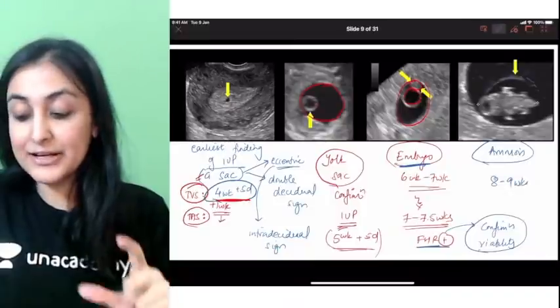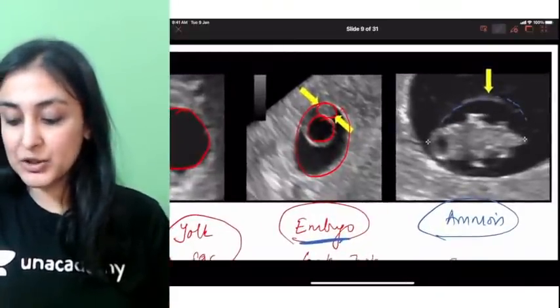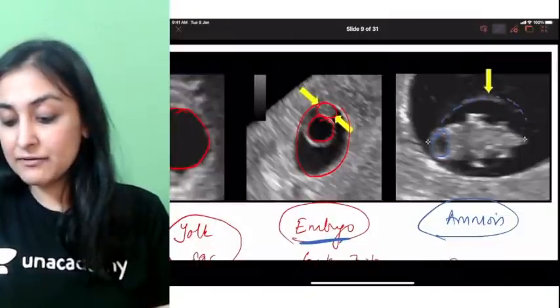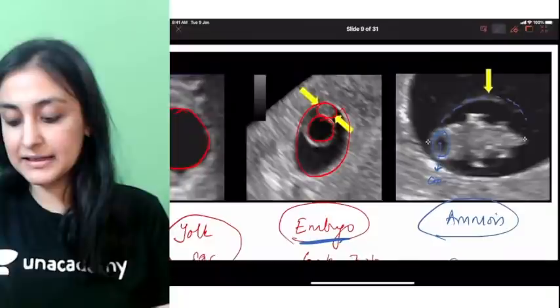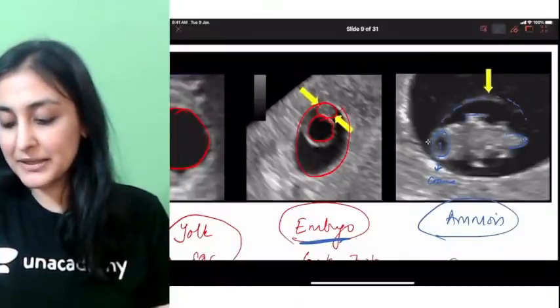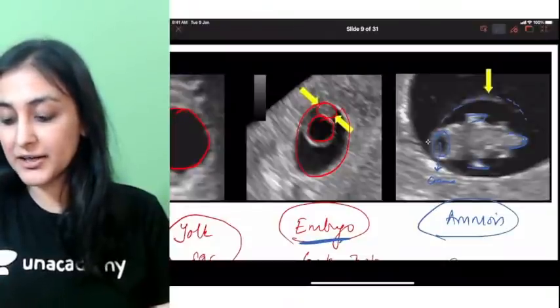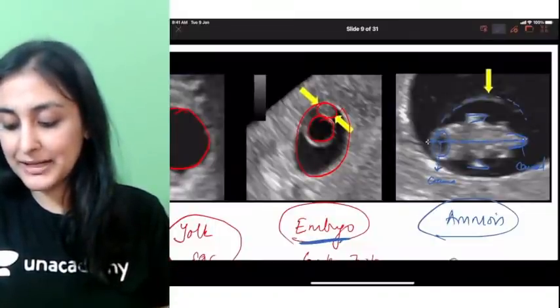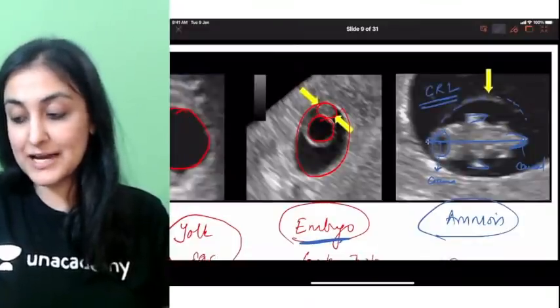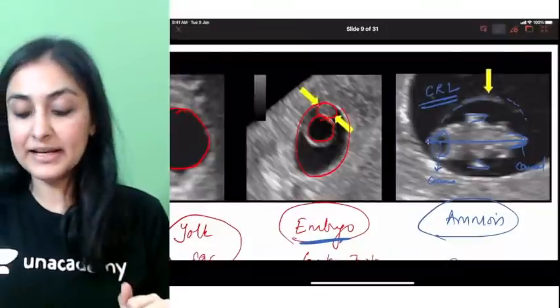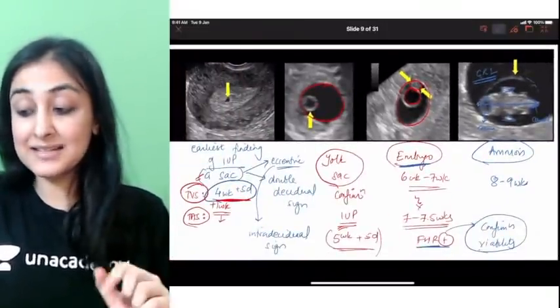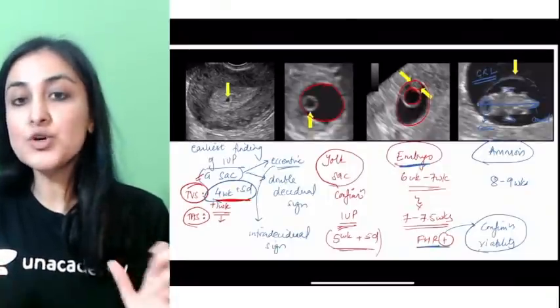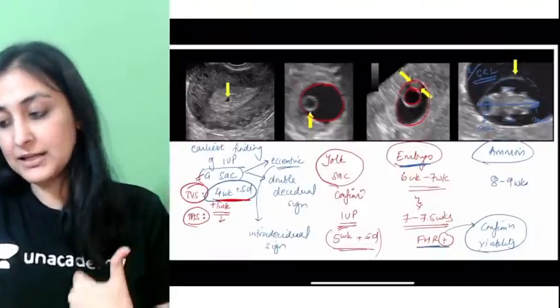At around 8 to 9 weeks I can see the developing organs. You can make out the cranial end — this is the rhombencephalon — and the caudal end, with limb buds forming. To measure gestational age, we measure the crown-rump length (CRL). The CRL is the most accurate marker of gestational age.